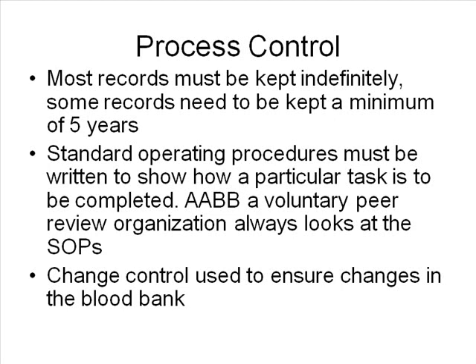So many times, labs will look at what is the AABB protocol for this particular policy and procedure and change accordingly. The minimum time that you should keep a record is 5 years. What record should be kept indefinitely?